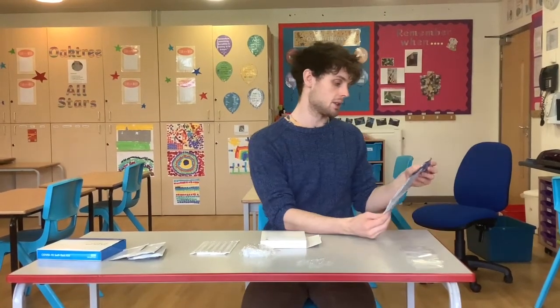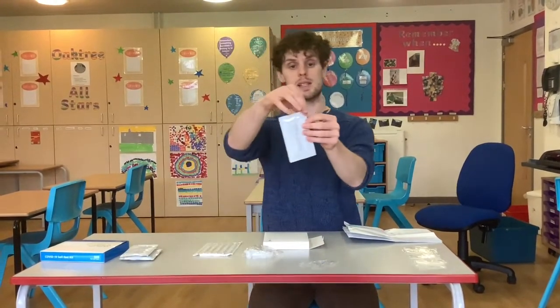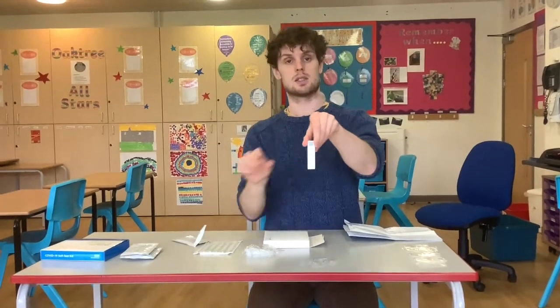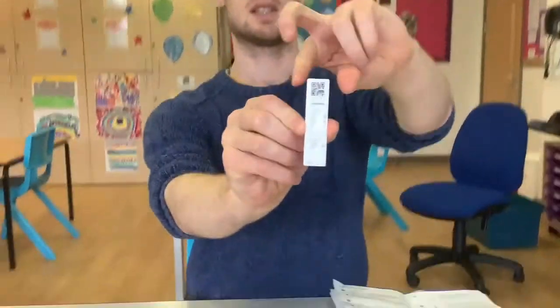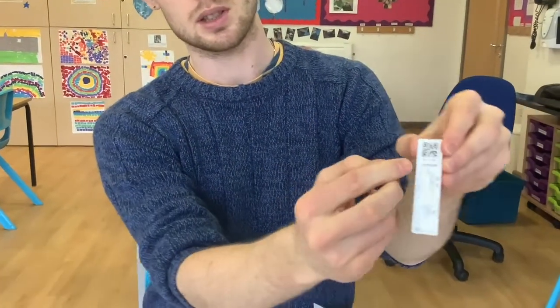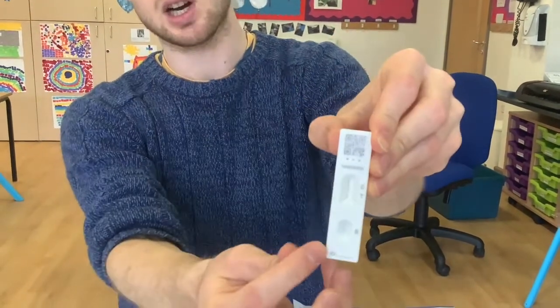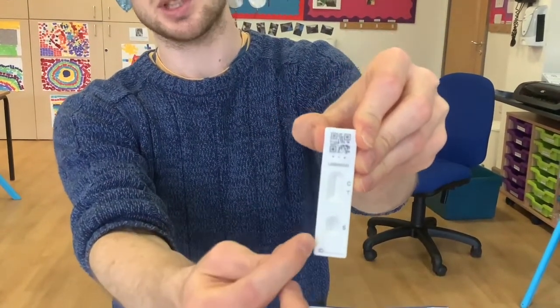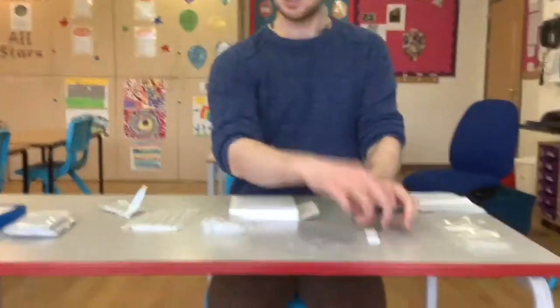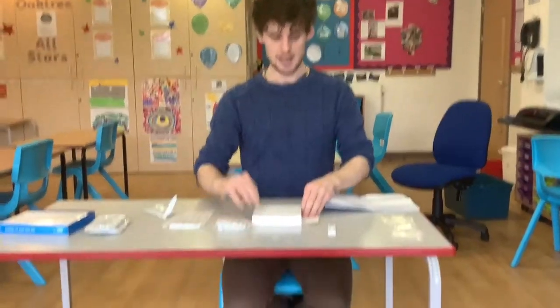The next thing you want to do is set up your test. You're going to take one of these white sachets and open it up. The test will look like this — it's got a QR code at the top, a testing strip where you'll see your result, and a well in the bottom where your sample is going to go, which has 'S' next to it. You want to put that on a flat surface.